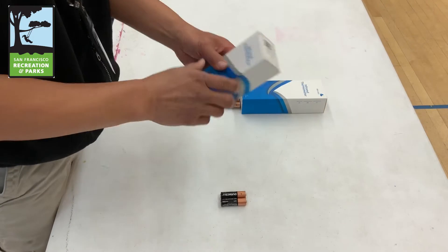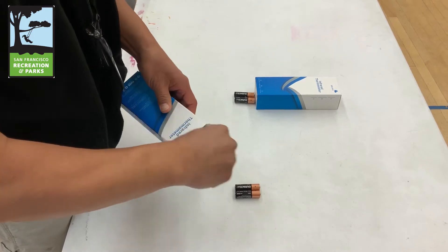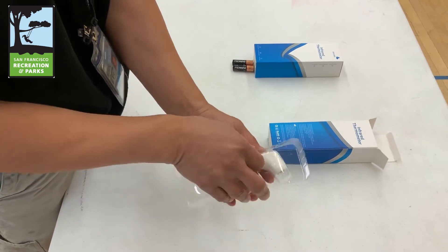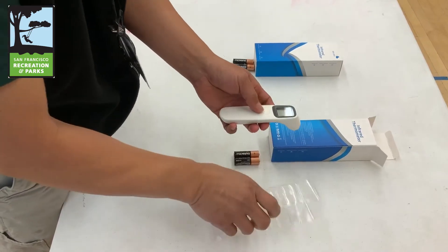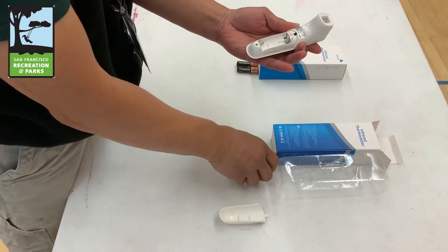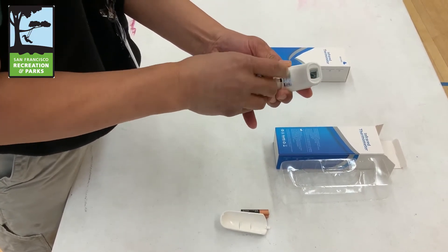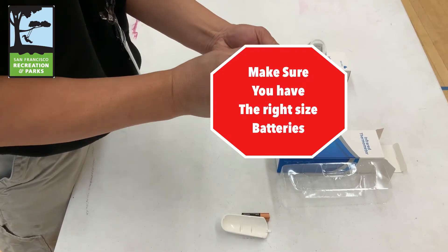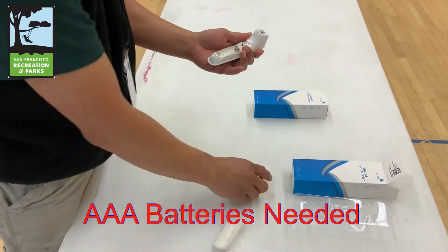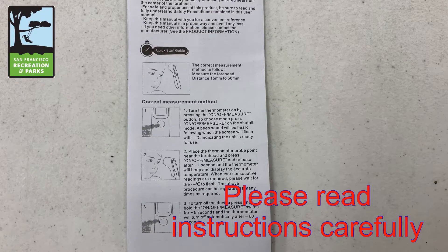Installing your temperature taker. Remove the temperature taker from the box and remove the plate from the back. Place the batteries inside — make sure you have the right batteries. Now that we have the right batteries, let's quickly show you how to install them. Please read the instructions carefully.